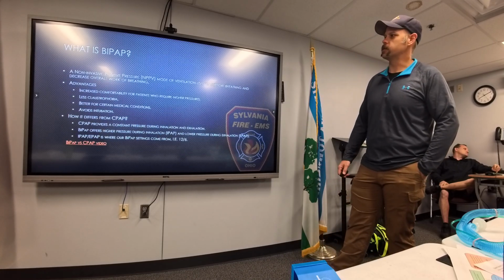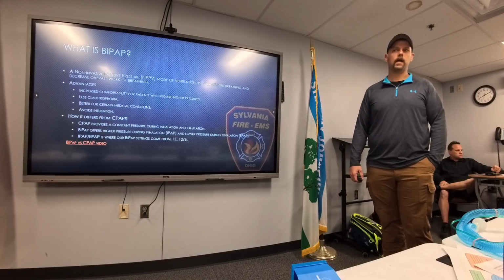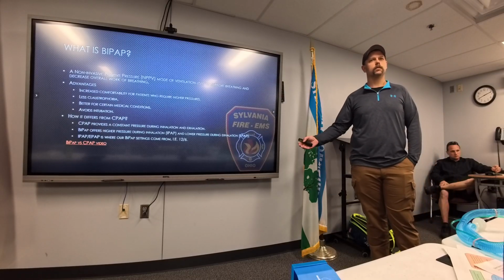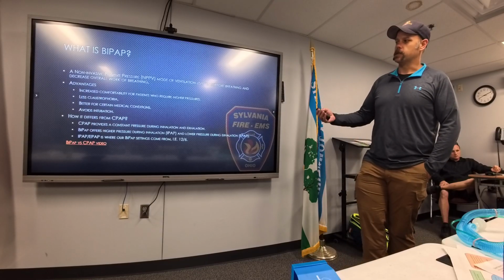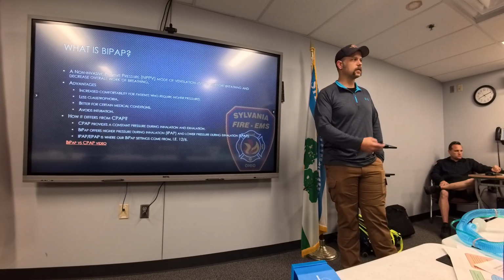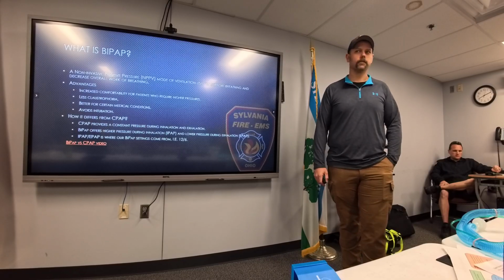BiPAP is a non-invasive positive pressure mode used to support breathing and decrease overall work of breathing. The advantages of BiPAP over CPAP: it's more comfortable. That's mostly the reason why hospitals use it. You still get your PEEP, you still get your pressures on the breath in. It's less claustrophobic, better for certain conditions, and avoids intubation. There've been numerous times in my career that we've been able to avoid somebody getting intubated because we got them on BiPAP soon and early, and they were able to turn them around before intubation.